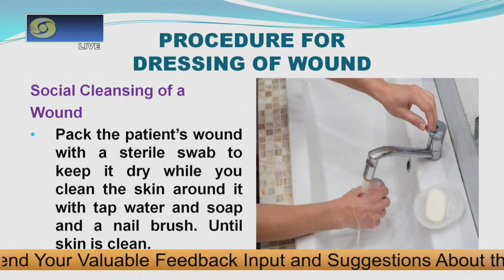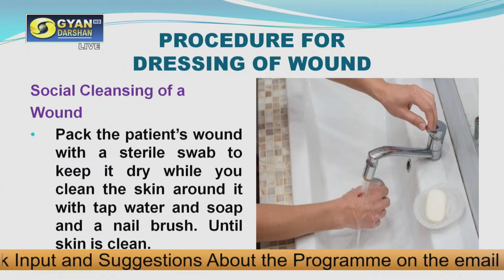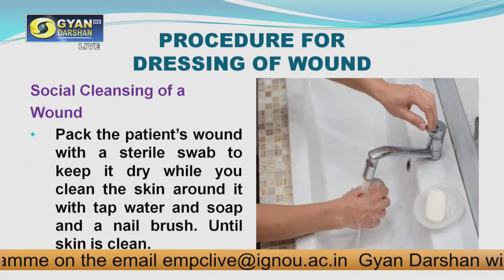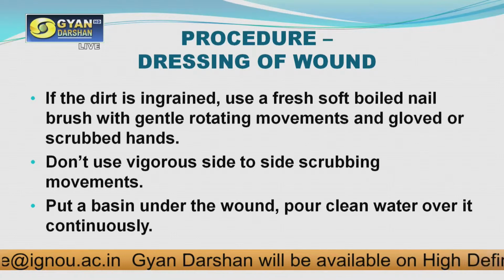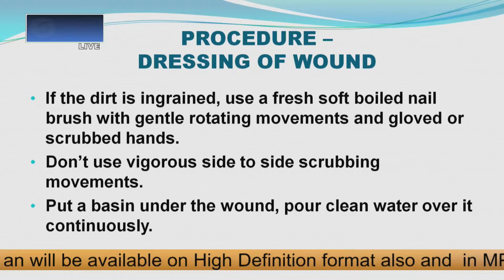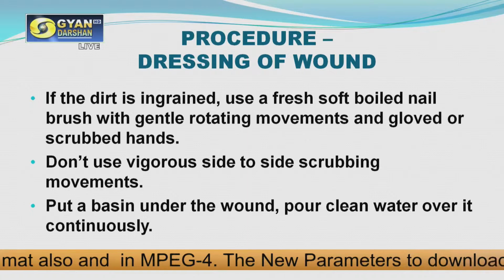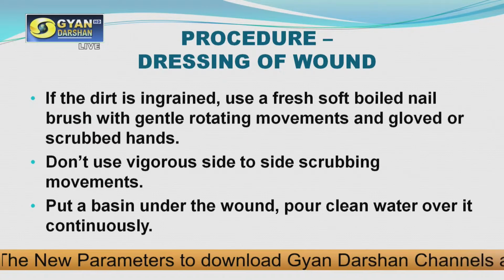And if the wound has more dust and dirt, you can use a nail brush until the skin is clean. If the dirt is ingrained, then you can use a soft boiled nail brush with gentle rotating movements and gloved or scrubbed hands.